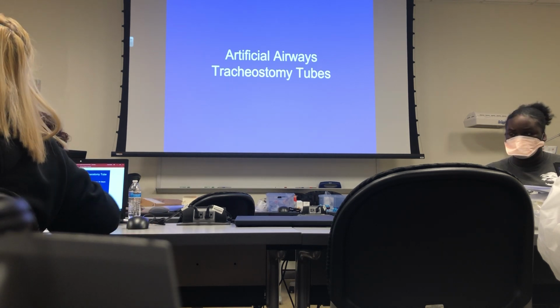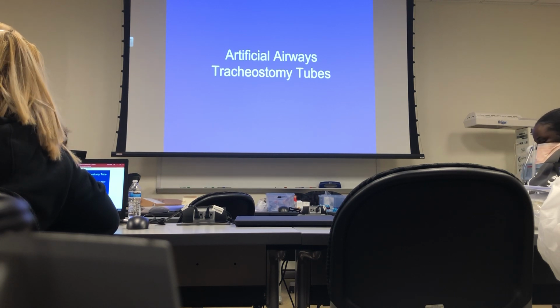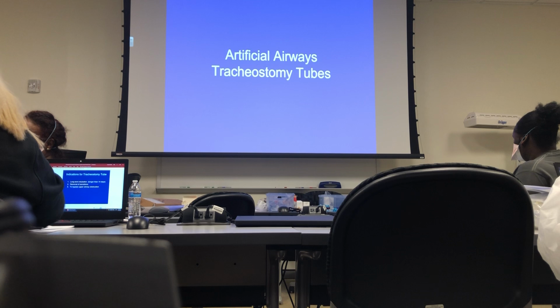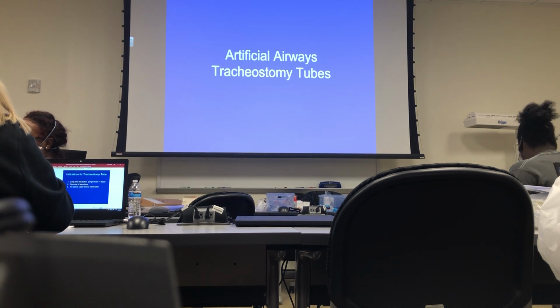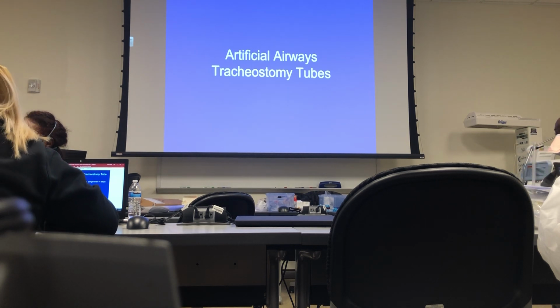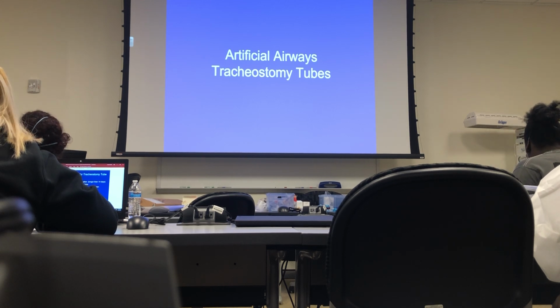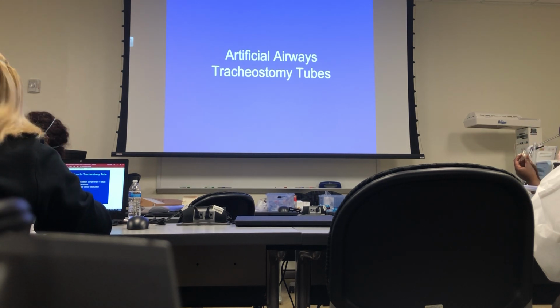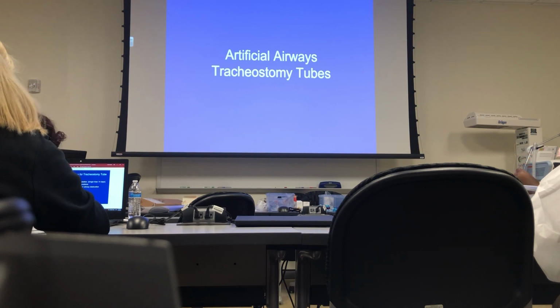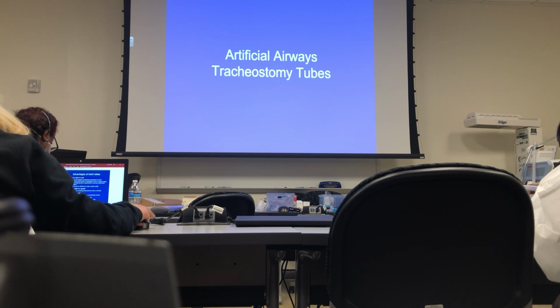You will see this in a patient's room, taped above the bed. Sometimes it's taped on the wall. If the trach was ever dislodged and it came out, you would take out the inner cannula, put this in, and feed the trach back in. Okay? Got it? So the obturator is used for insertion of the trach to prevent mucosal trauma. That's it. Okay? You have the inner and outer cannula.